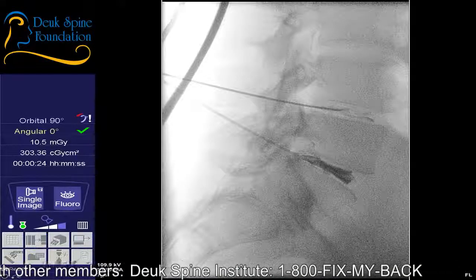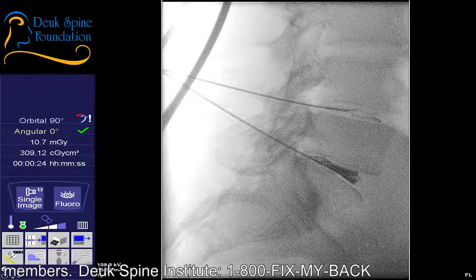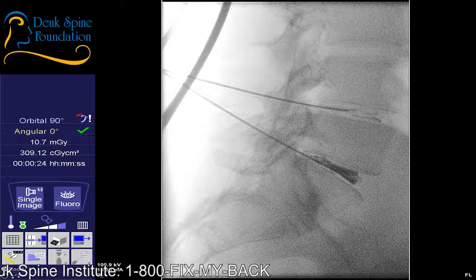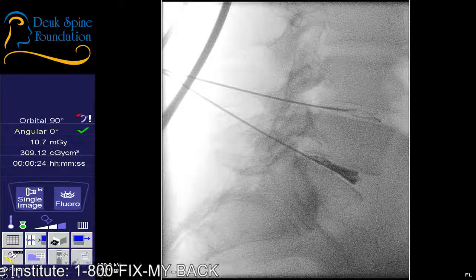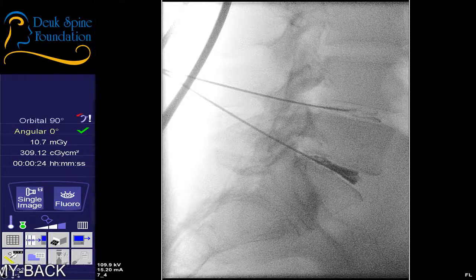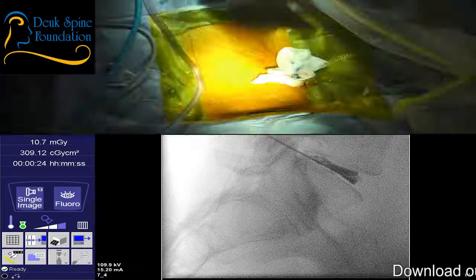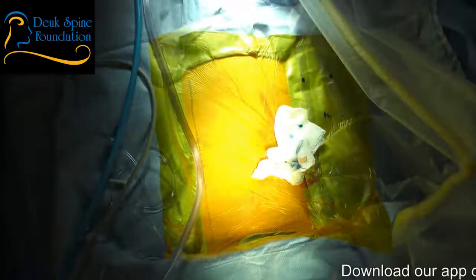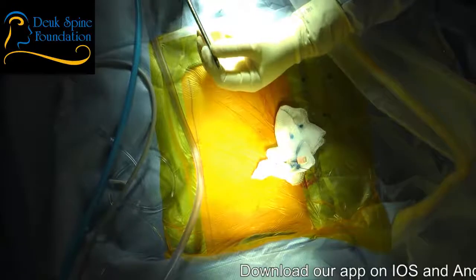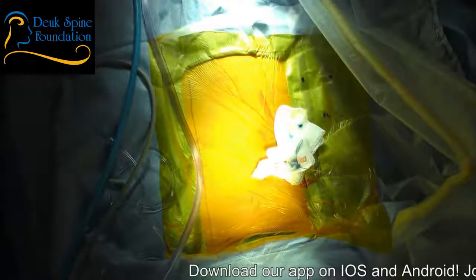Let me know when he's asleep. All right. We're going to get started. Can you count out loud for me? All right. So I've got the guide wire in. I'm going to bring the needle out. Okay. And we're going to use this guide wire to guide our instruments to do the surgery. Specifically, the guide wire will guide this guy first. This is called the dilator. That's my shot right there.